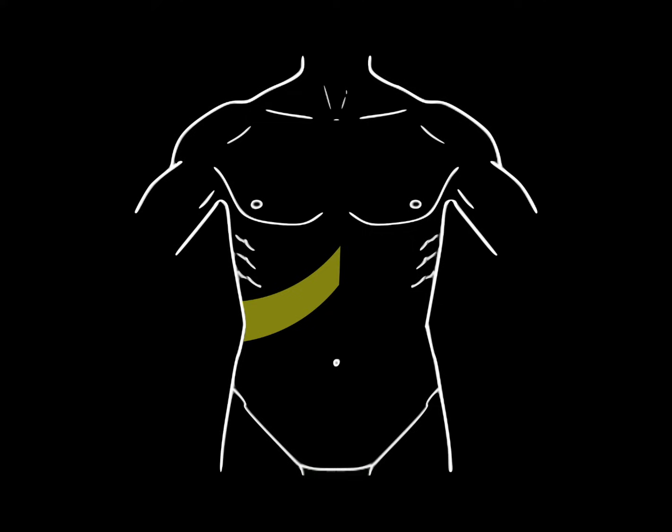I follow a specific sequence every time I image the gallbladder, and we're going to go through that sequence. I like to start with the probe marker towards the head, right in the midline, as we see here.